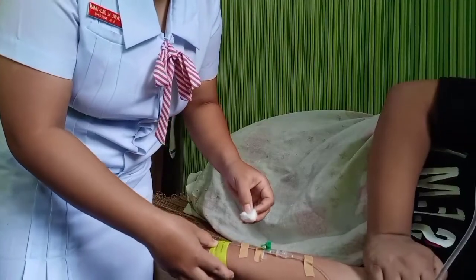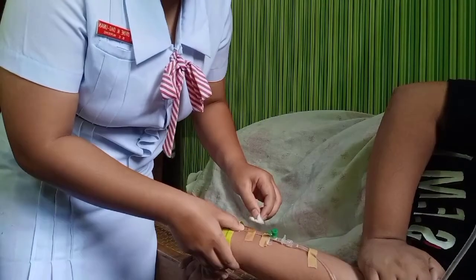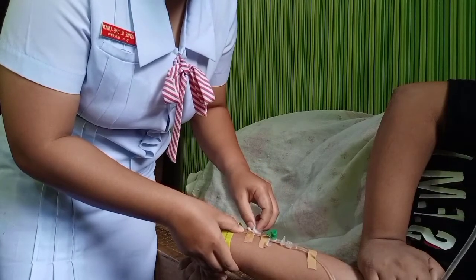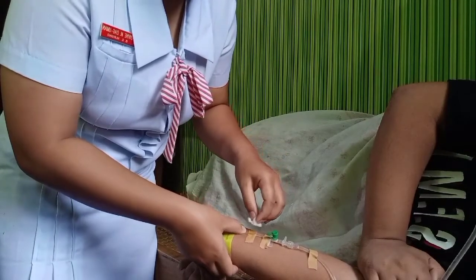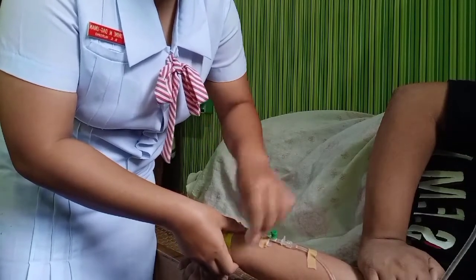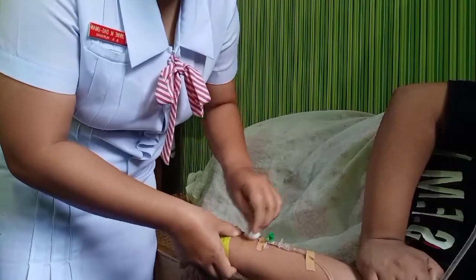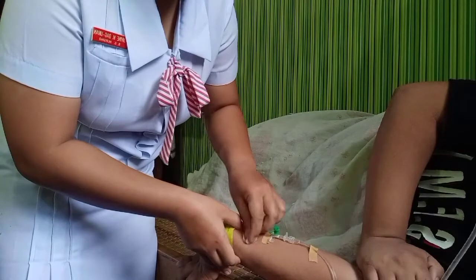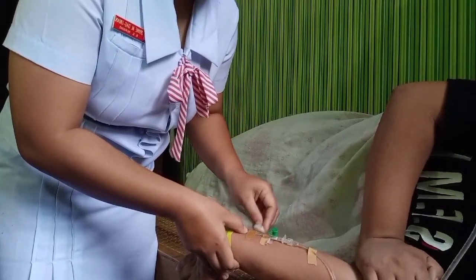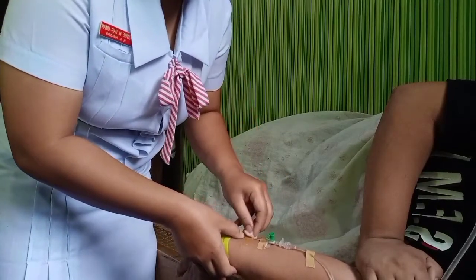So wiping the patient's area with the plaster, we use cotton balls with alcohol swab on the plaster attached to the patient's tube, to minimize the pain caused by the connection between the tape or plaster and the skin.